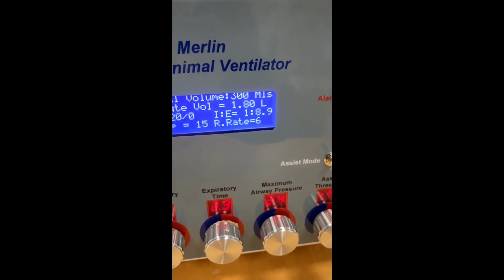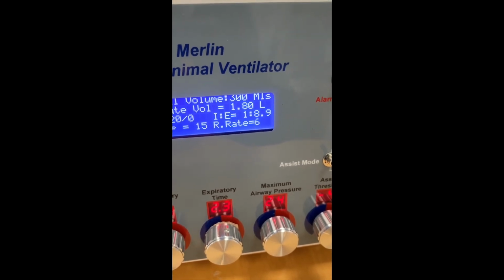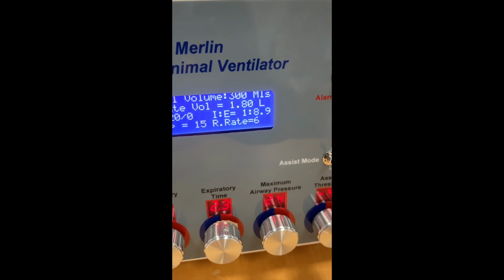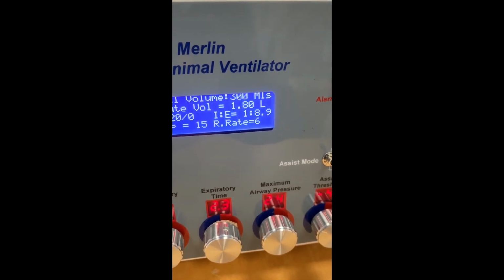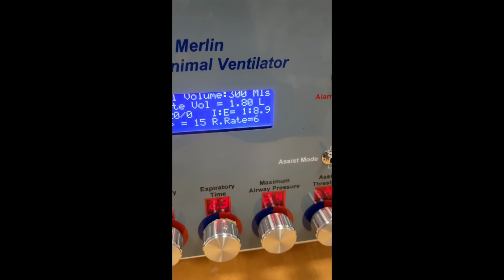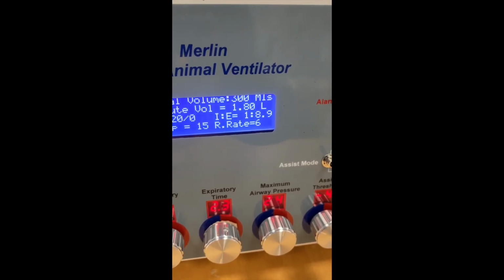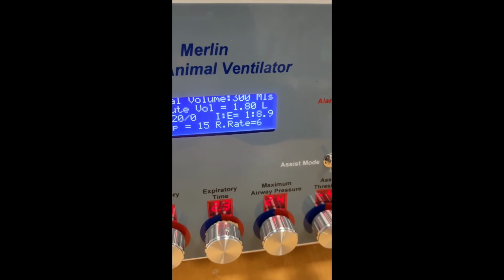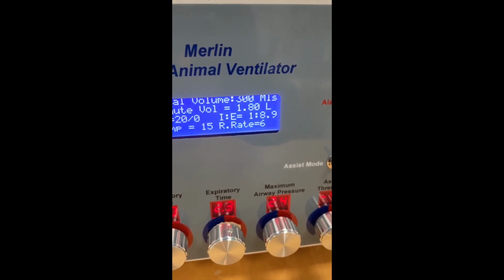So in other words, with a respiratory rate of 6, we have 10 seconds between breaths. If there's no patient effort, as what's occurring in the background, every 10 seconds we get a beep and the breath is given by the ventilator. If, however, the patient were able to take a breath and trigger the breath, then the interval between the start of that and the next mandatory breath would be reset to 10 seconds.